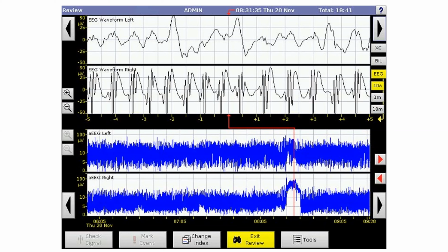And then not until we get almost here, a few minutes into the seizure, does the upper amplitude also begin to be influenced. As the seizure continues and becomes more rhythmic, the differential between the voltages of the seizure becomes smaller and smaller and smaller. And this is what causes the compression or the thinning of the aEEG band.